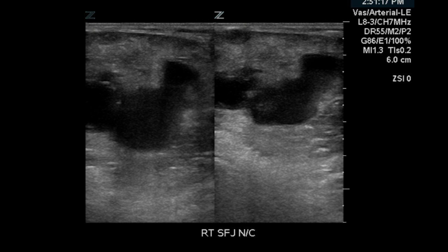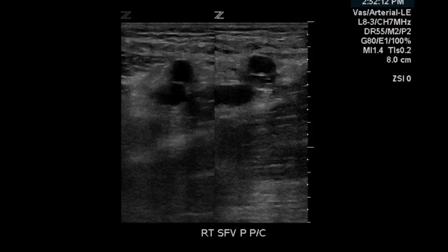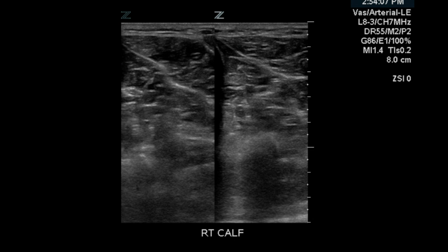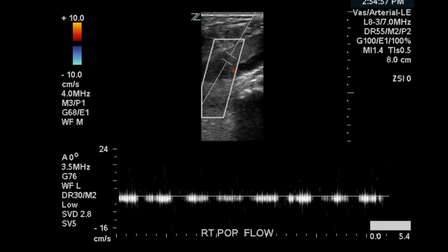We were also tasked with determining if there were any effects on the venous system. We looked at the common femoral and found the vein did not compress. You can see the same can be said at the femoral vein proximally. There's a proximal partial compression of the femoral vein. However, the remainder of the veins on the right side are fully compressible. Moving back to the popliteal, we see pulsatile venous flow.